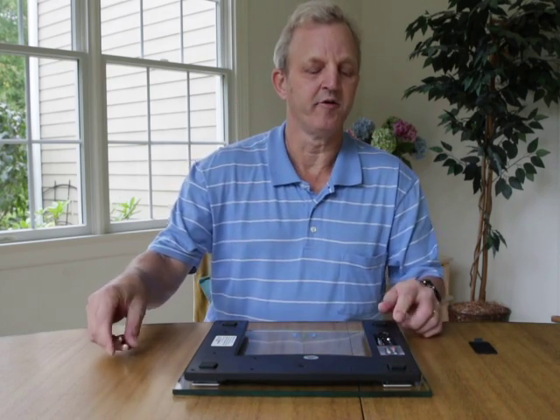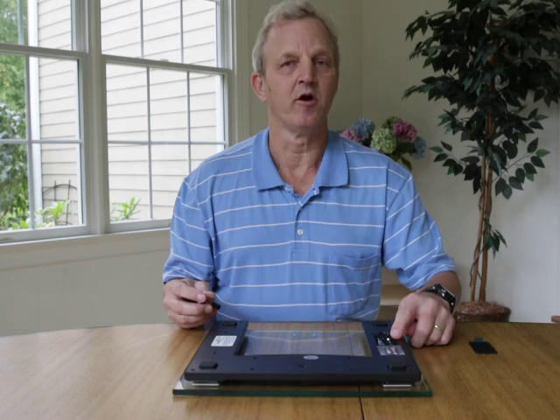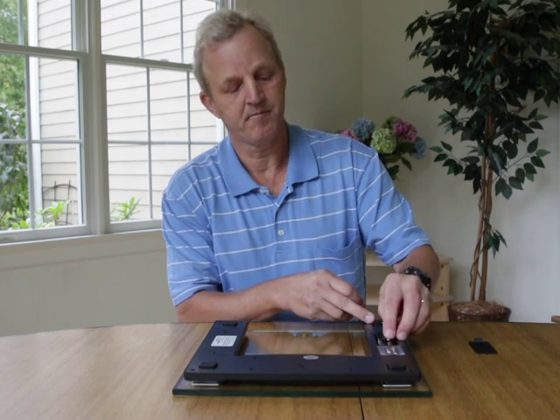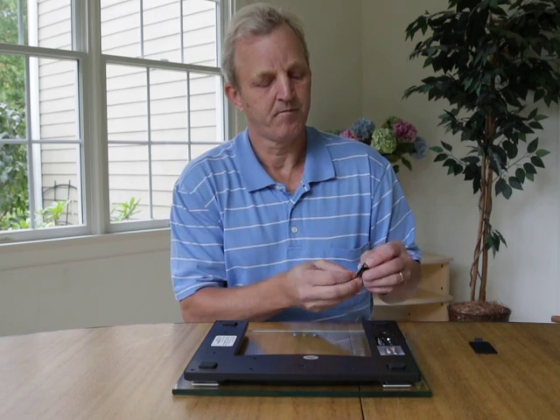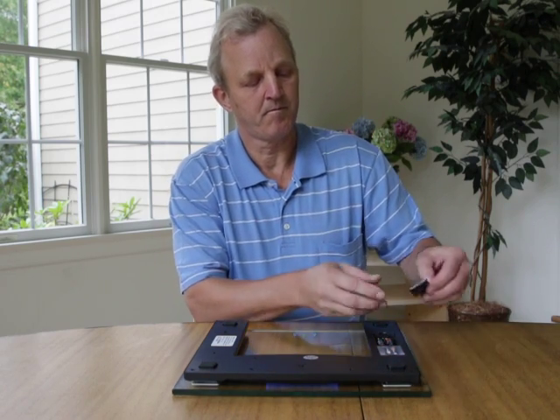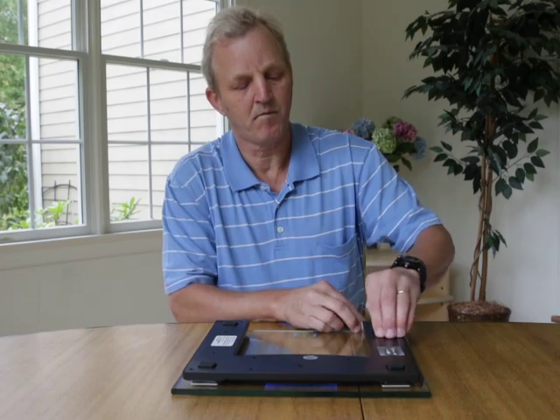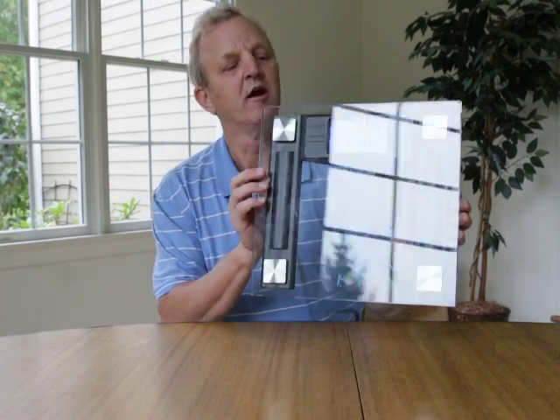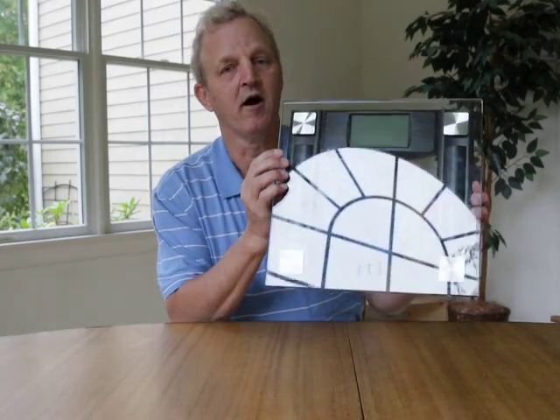On the other side of the battery compartment, the batteries go in the other direction with the flat side up. When the batteries are properly installed, you will see the blue display on the screen.